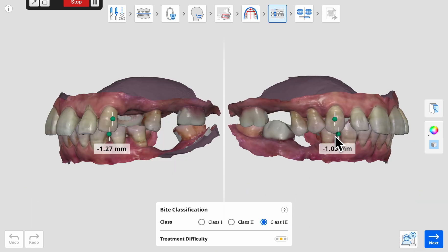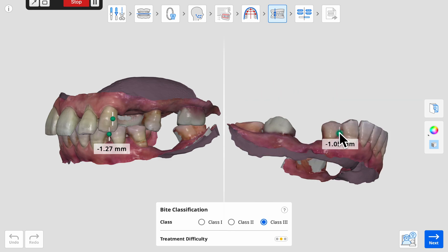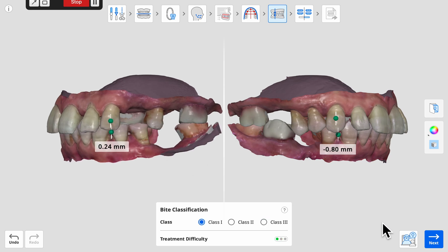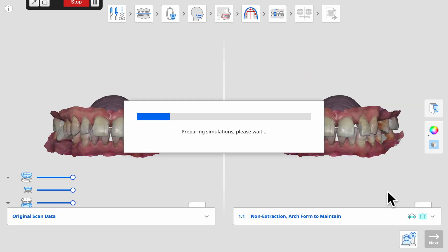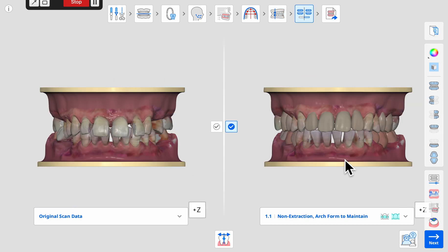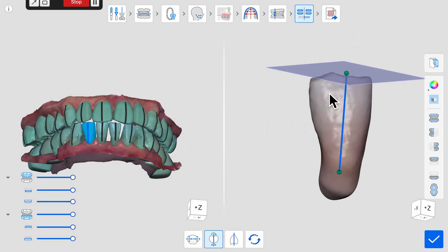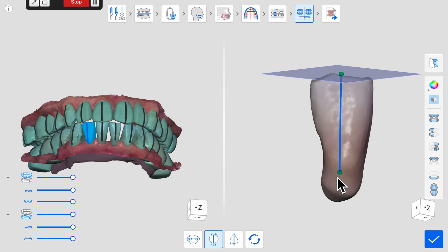The posterior bite is then classified by using molars if present, or by cuspids or canines if the molars are missing, as seen in this example. The app then uses all of this data to generate a series of alignment simulations. Individual tooth alignment can be corrected as needed using the tooth orientation tool.